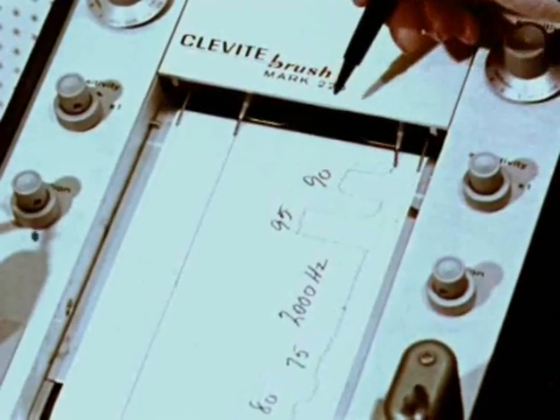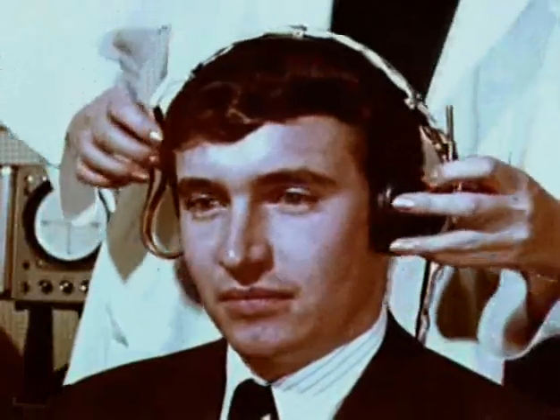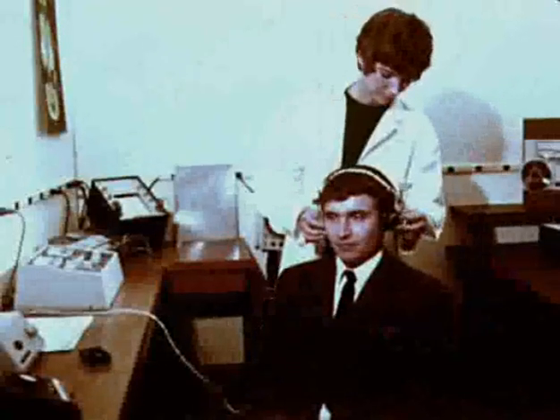Tests of stapedius function aid in establishing the level of a facial nerve paralysis, for if it is above the nerve of the stapedius, the muscle will not contract. When testing facial nerve function, the ear with a probe becomes the ear under test, for here the efferent arc is in doubt.